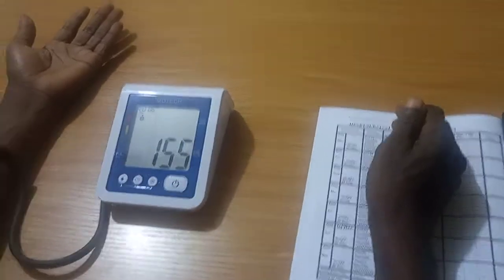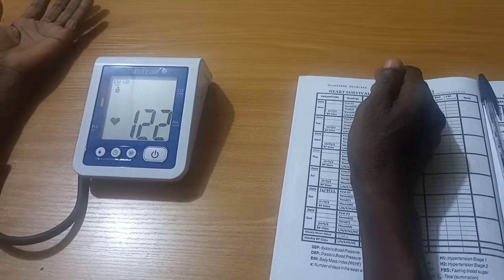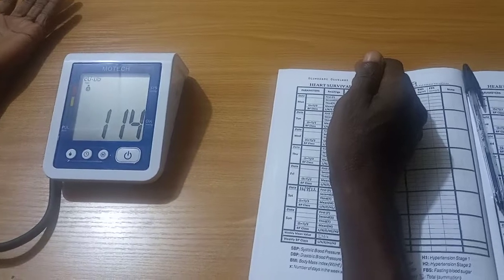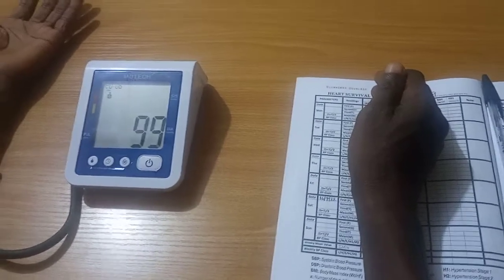The BP monitor will display three figures. The upper figure is the systolic blood pressure. The middle figure is the diastolic blood pressure, while the lower figure is the pulse rate.